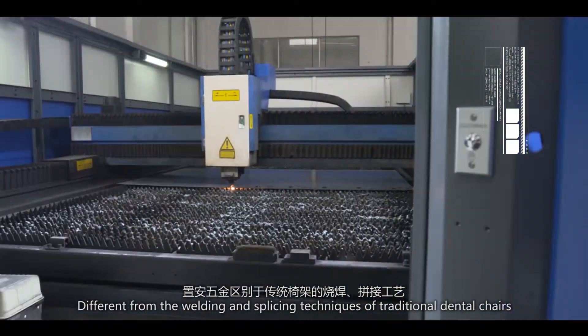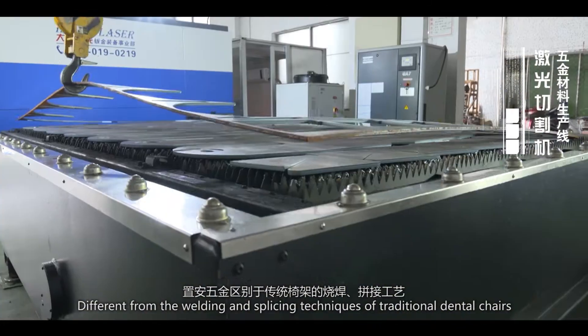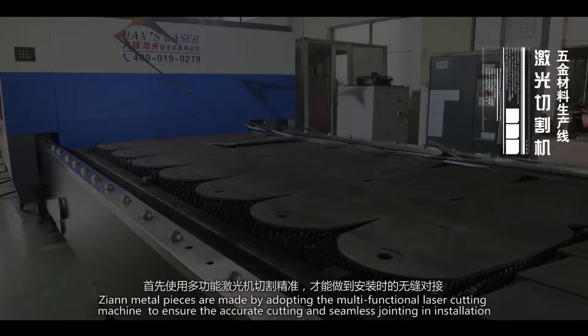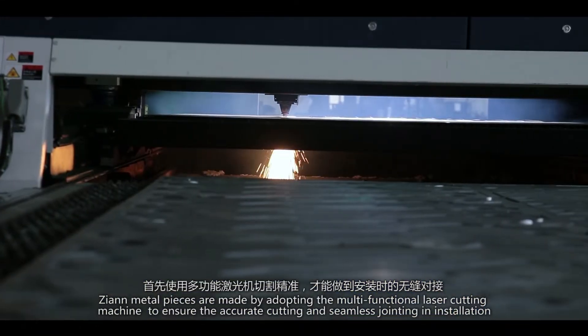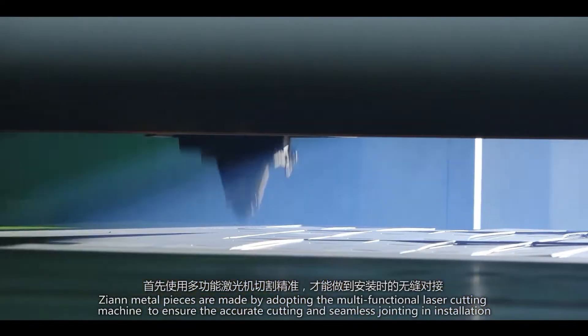Different from the welding and splicing techniques of traditional dental chairs, Zhiyuan metal pieces are made by adopting the multifunctional laser cutting machine to ensure accurate cutting and seamless jointing in installation.